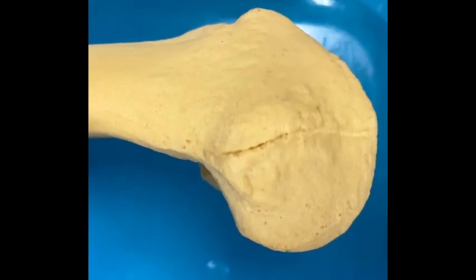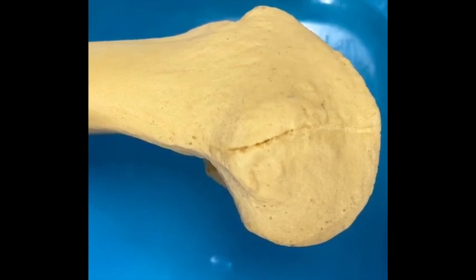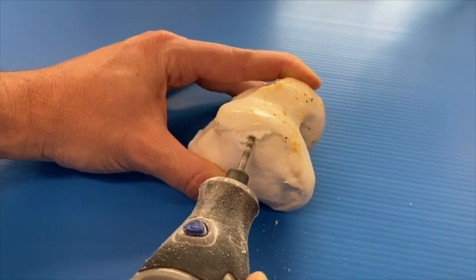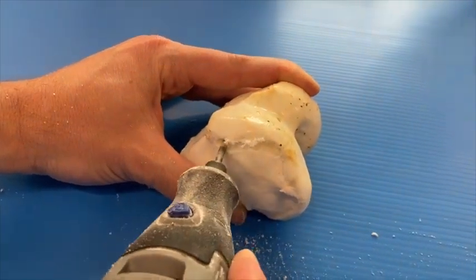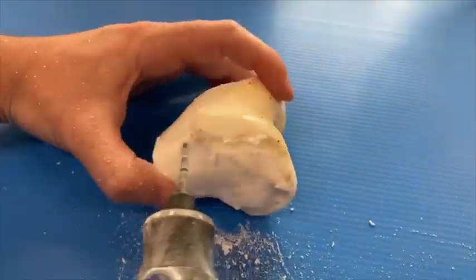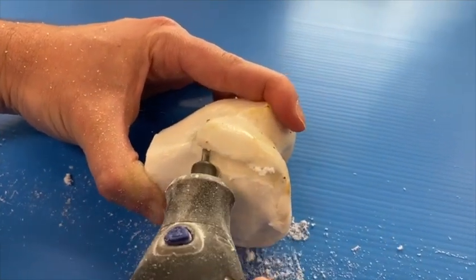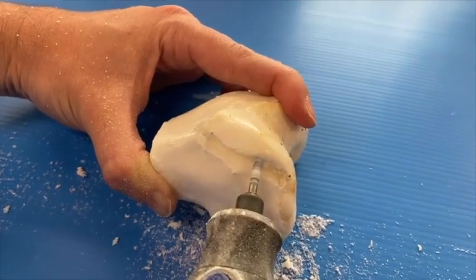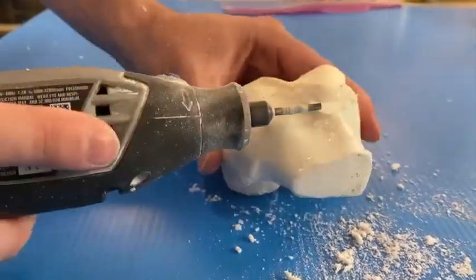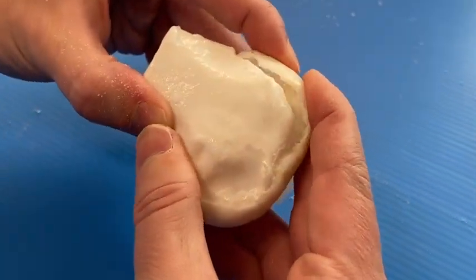Existing sawbone and cadaveric models mostly represent normal patellofemoral joint morphology. The pliable materials used in our model allow for easy modeling of supratrochlear spur recession using a high-speed burr or drill. Care should be taken to remove the material below the supratrochlear spur, which represents subchondral bone, without compromising the overlying osteochondral surface. After recession of the modeled subchondral bone, 3D printed suture anchors can be easily added, spanning the trochlea for trochleoplasty reduction to the underlying bone.